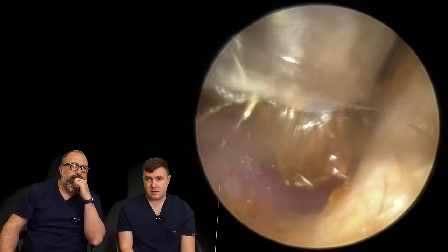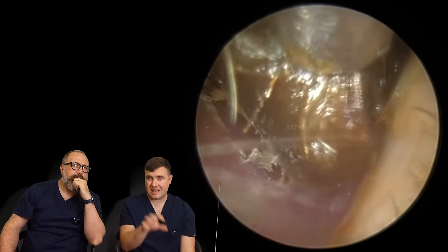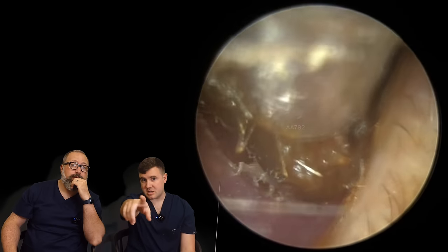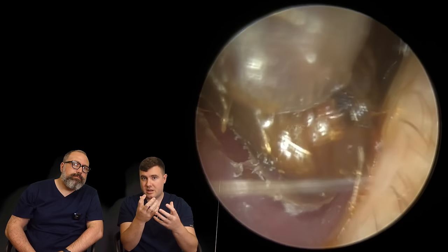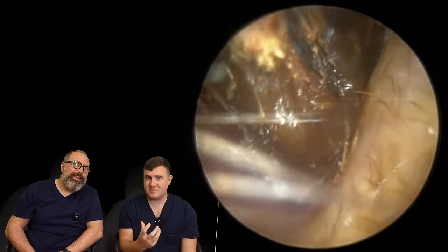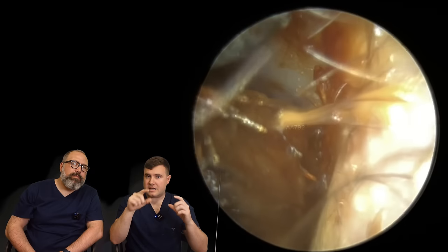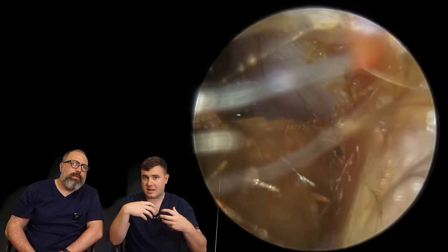That's why I've opted for the standard size Zolna tubing. You can still see underneath it, as we're lifting this, there's still a lot of dryness underneath where the oil hasn't fully penetrated through this wax. It's almost like the skin was welded to that canal wall. And that's the dryness you saw on the other side. Just underneath that plug is where that skin is just holding onto it. So the reason I'm wiggling around here — we're just trying to break that away, which should happen anytime soon.